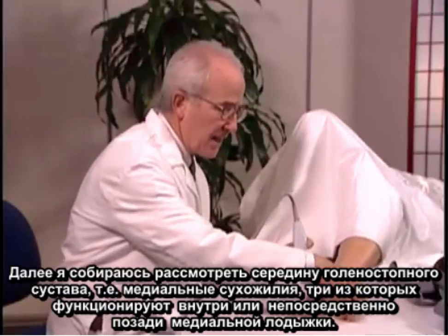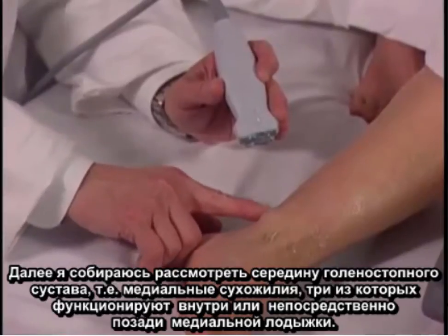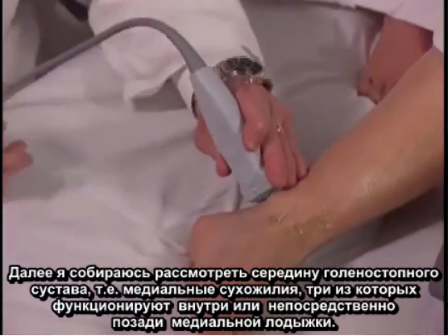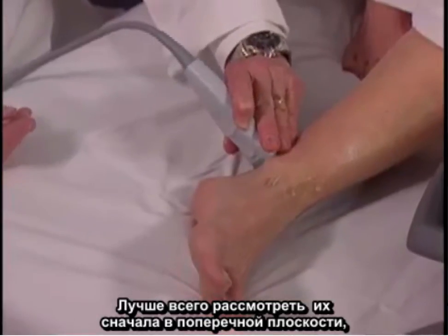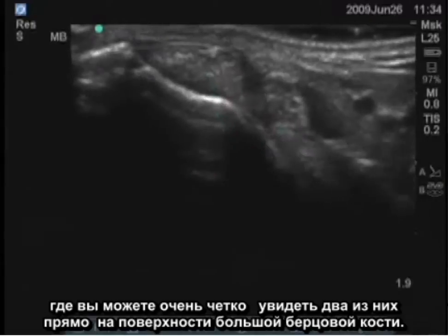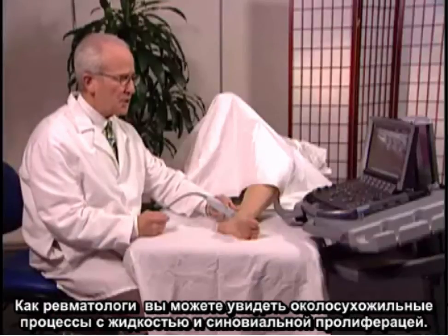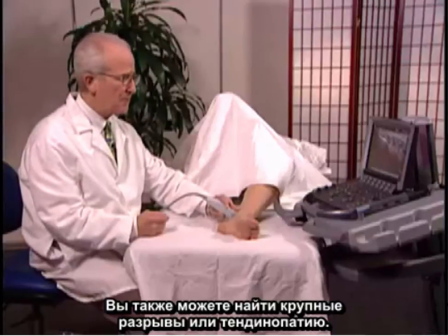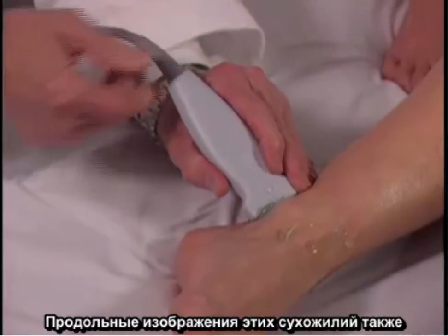Next, I'm going to examine the medial aspect of the ankle. The medial tendons — three of them — run just inside or just posterior to the medial malleolus. It's best to examine these initially in the transverse plane. You can see two of those tendons very clearly, right superficial to the tibial bone. As a rheumatologist, you can see peritendinous processes with fluid and synovial proliferation, and you can also find large tears or tendinopathy.